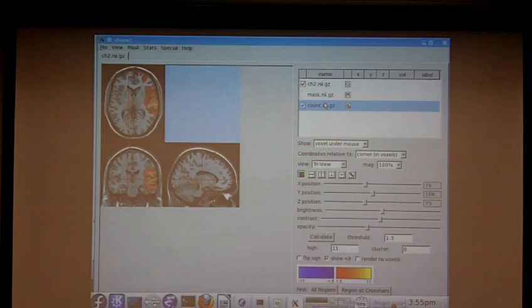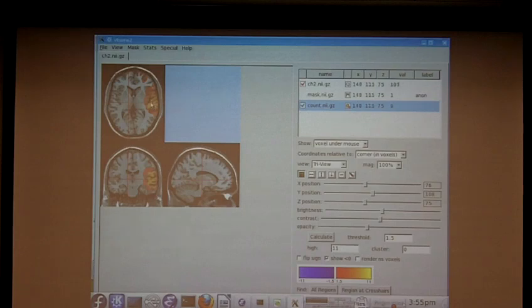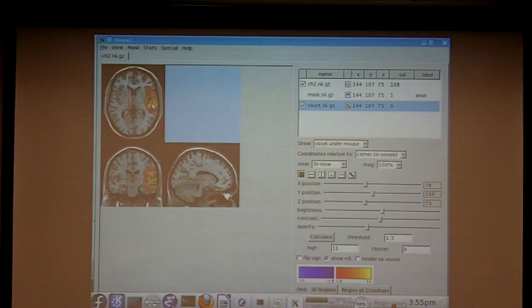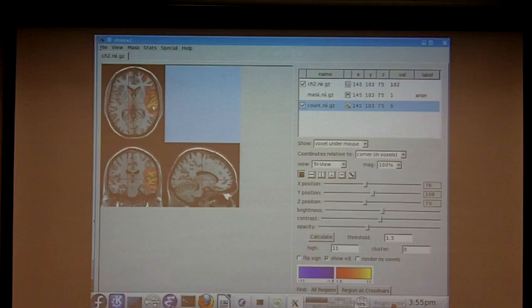And we can see that they cover exactly the same area. It's just that the mask has ones in those places because you quantized it and the count map actually tells you how many lesions there were in each voxel. And you can surf around and see what your coverage is like. So as you move your mouse, you can see what the value is in each voxel for each of the layers. So we can see in this voxel there are nine lesions out of the 24 patients.